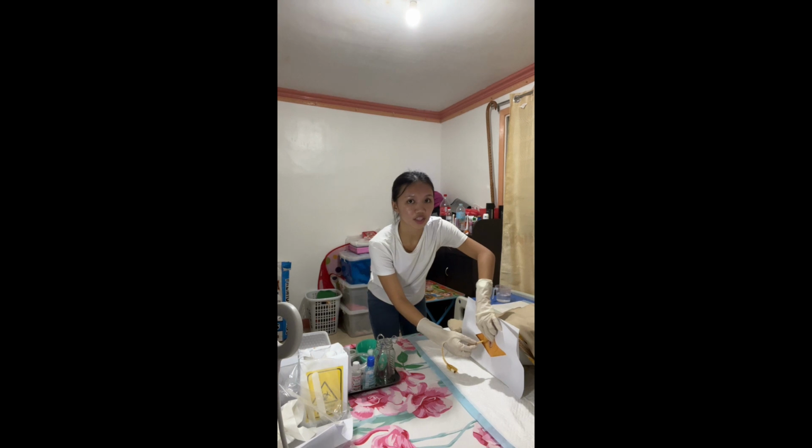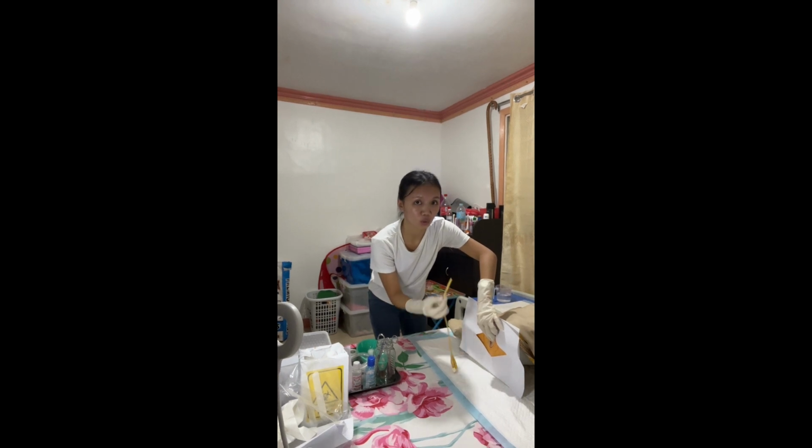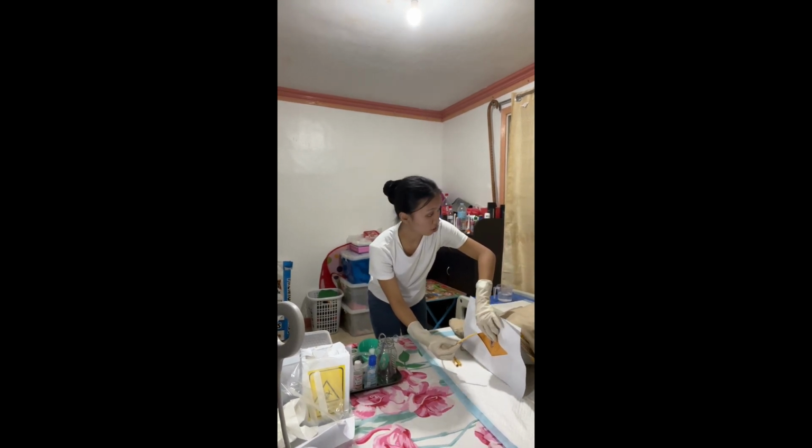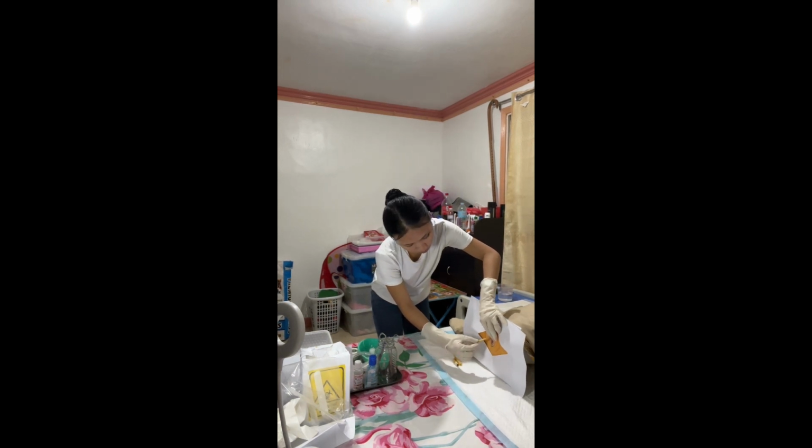Next is to insert the catheter into the meatus for 2 to 3 inches or until urine begins to flow. So now we are going to insert. Now ma'am, I am going to insert the catheter in your urinary urethra meatus. Okay.